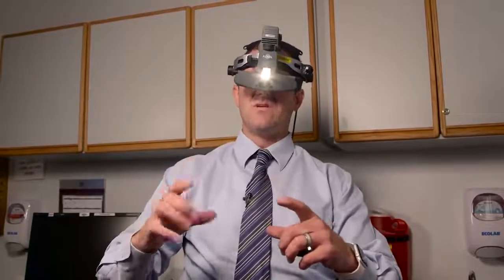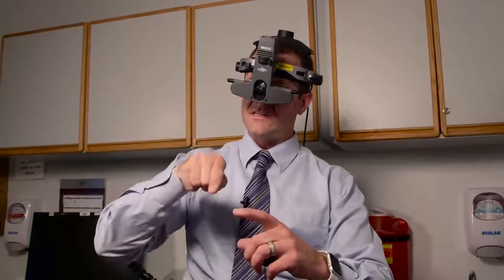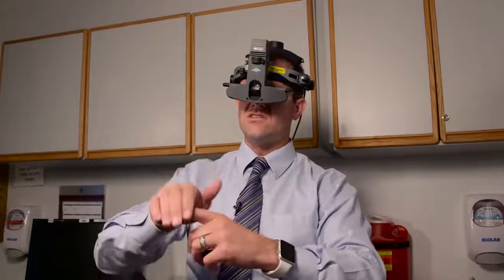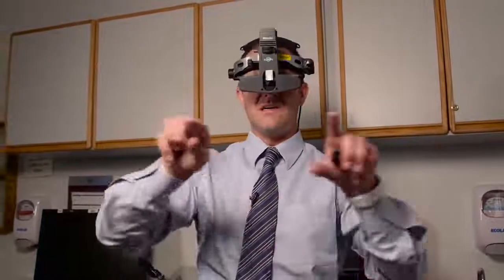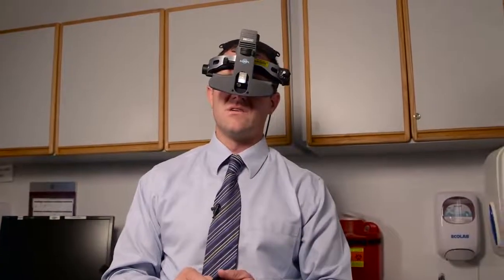So the posterior segment of the eye is like a fishbowl where you have an opening in the top, and just like when you look down in the fishbowl, you can see everything that's straight back. Well, you can't see what's up underneath the rim of the fishbowl unless you stuck your head in there and looked up there. And so the scleral depressor allows you to press in underneath that lid of the fishbowl so you can see way out to the side of the eye. And that's commonly where disease processes occur, out by the ora serrata. That's the indirect exam.